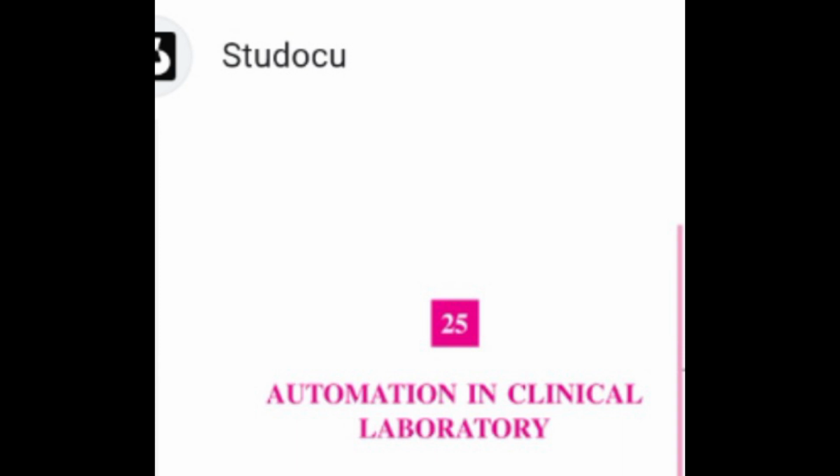There are various automated systems commercially available to analyze all blood, CSF and urine parameters. The demand for increased efficiency in healthcare prompted laboratory owners to provide fast service at lower cost. It is necessary for laboratory directors to plan which type of instrument to purchase, keeping in mind that there should not be any compromise with the accuracy of the test. The systems are selected to fit a combination of automated, semi-automated and manual modes of analysis. This is suited to any particular laboratory for the type of work and workload.